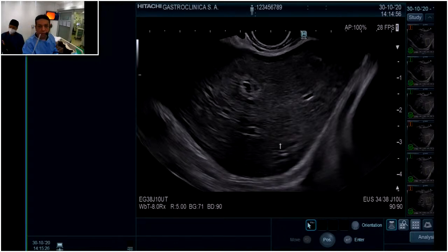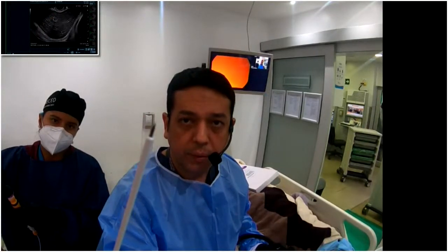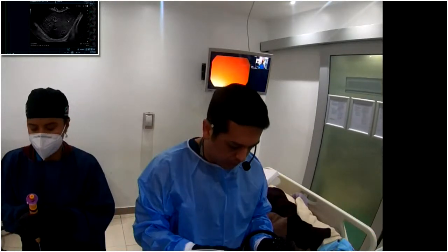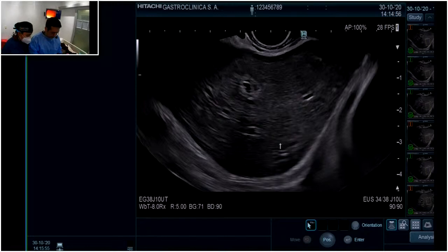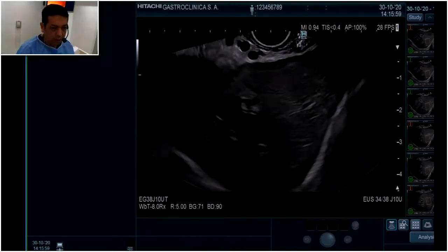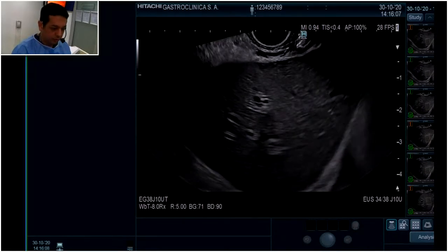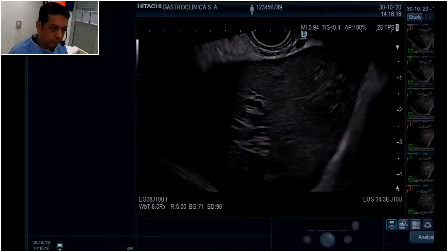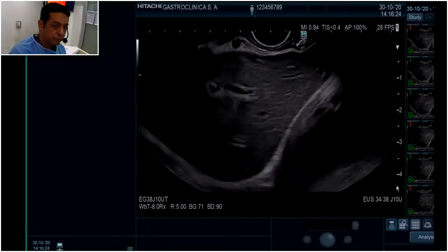Okay. So you can see here the shark core is a different kind of needle that helps us to have a better tissue for evaluation. Okay, so guárdala y el estilete. Okay. So now I am using the endoscope. This is the J10 series scopes from Pentax Medical. And it's necessary to have Hitachi Aloka 850 to have this technology in your units. Okay. So now I will fix now. So my idea is to go to this part, this segment of the liver.